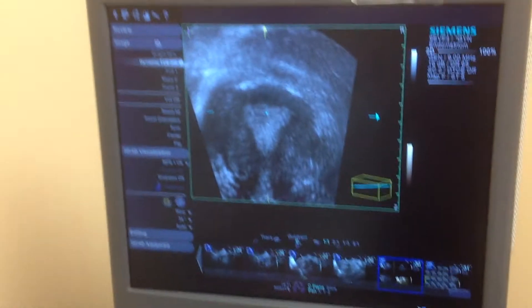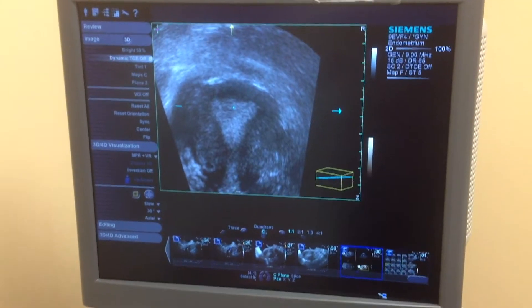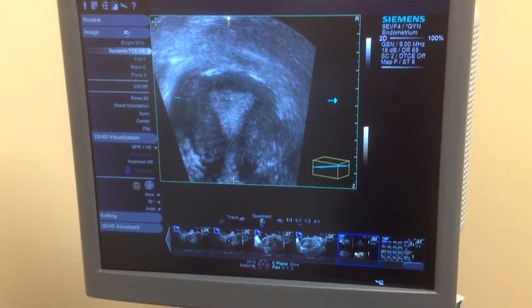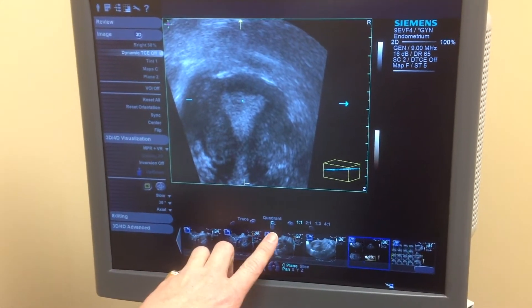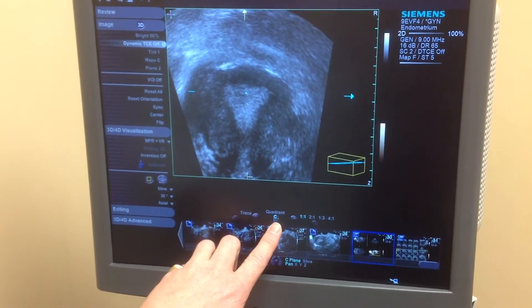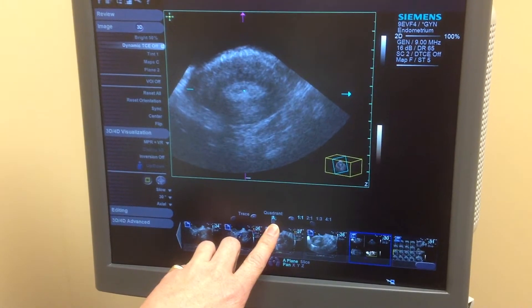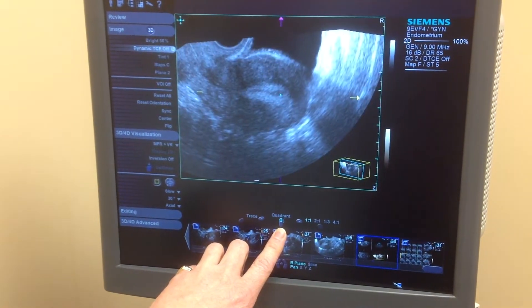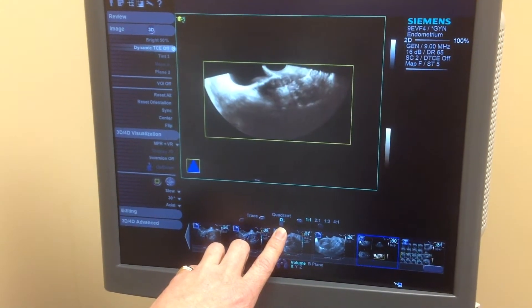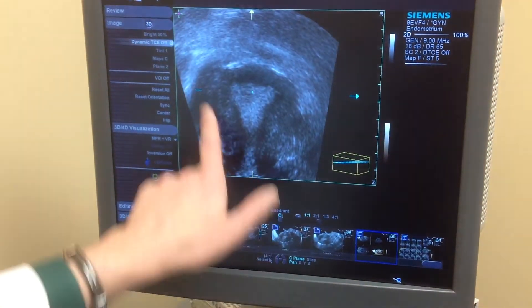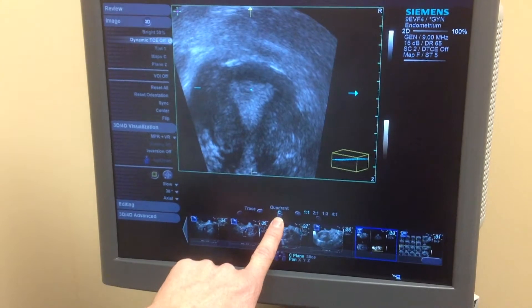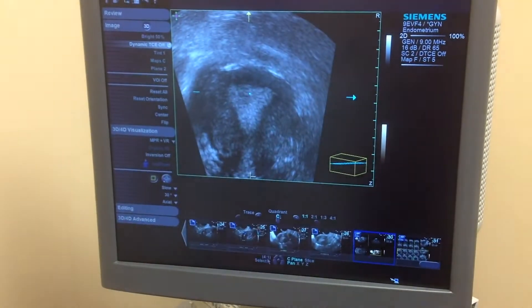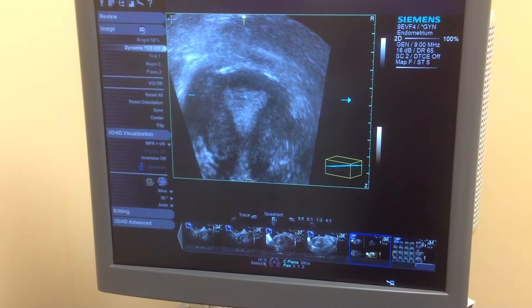If I want to change to a different quadrant to see that particular image, I just rotate the thumb wheel. Here I'm on quadrant C, which is that particular image there.